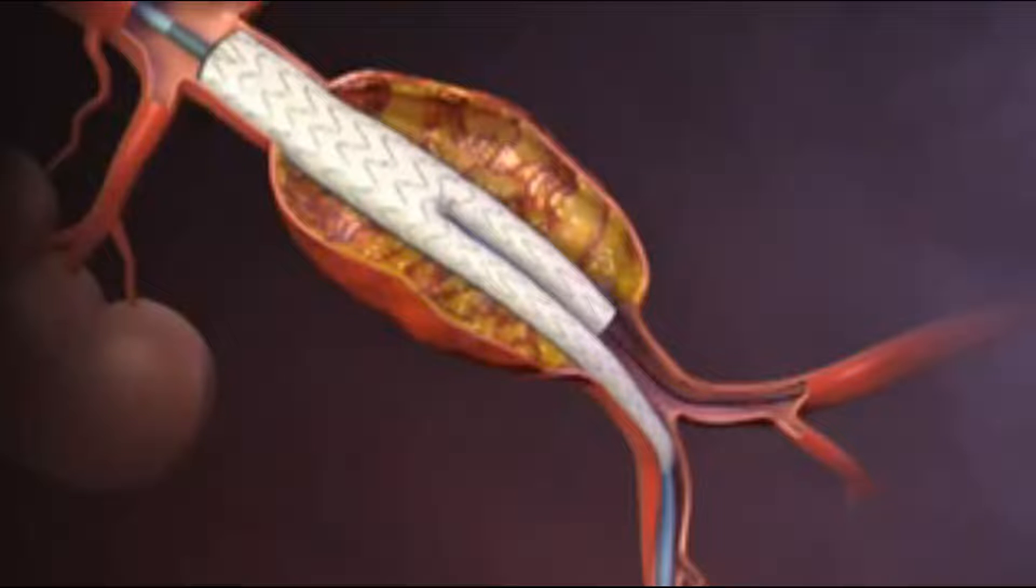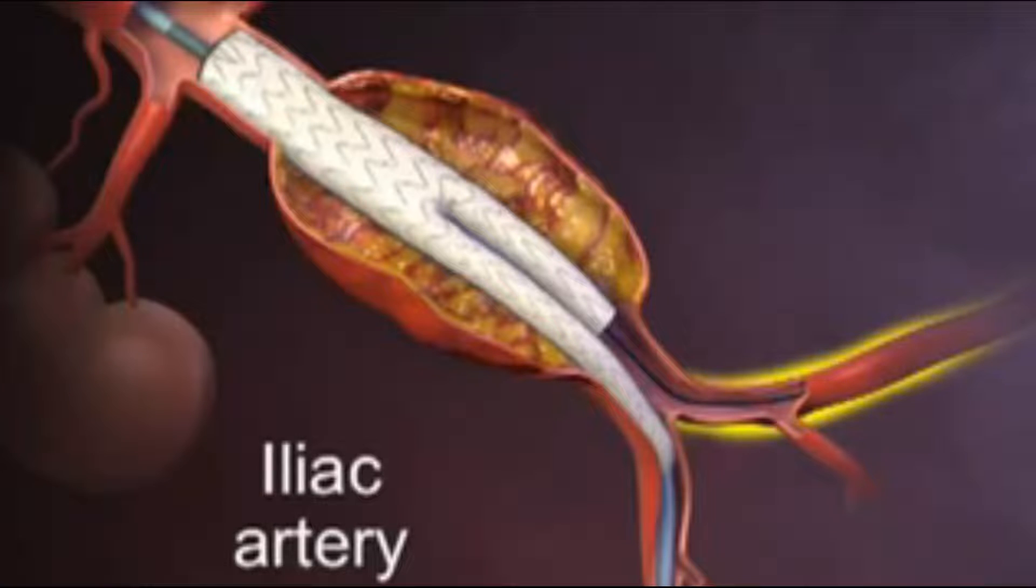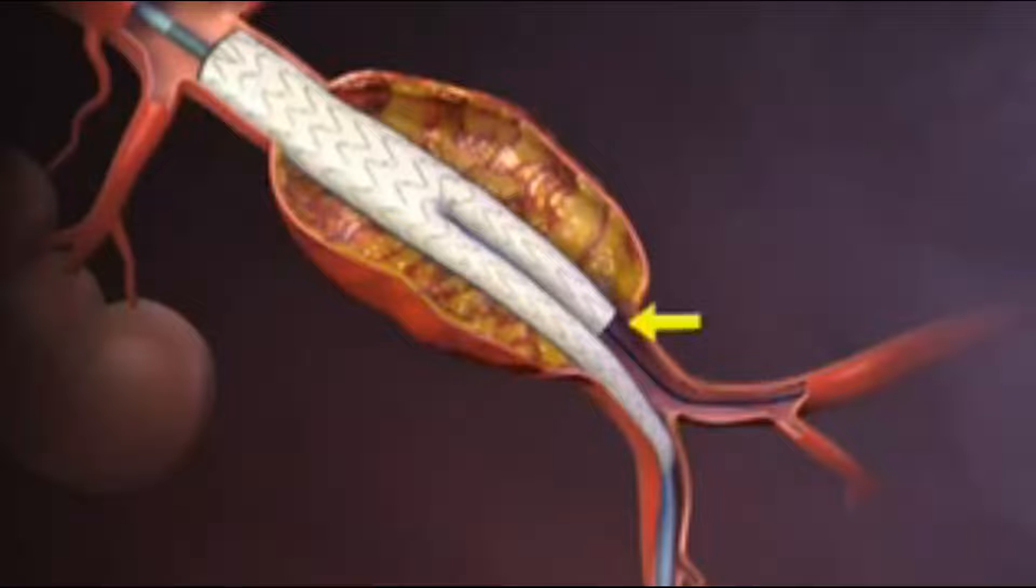A second guide wire is introduced through the contralateral iliac artery into the open lumen of the contralateral limb of the stent graft.